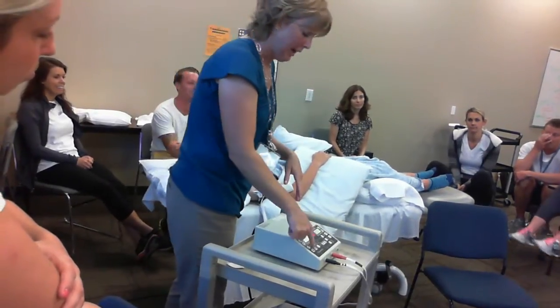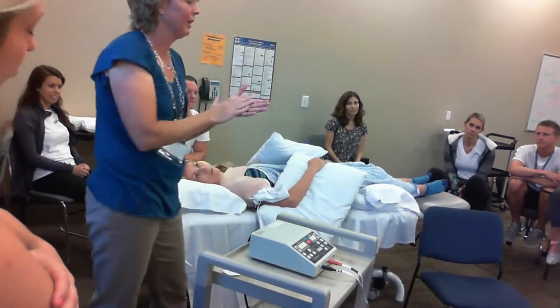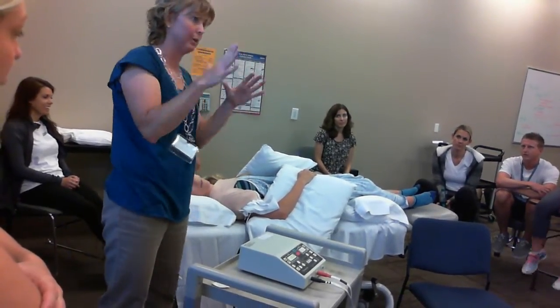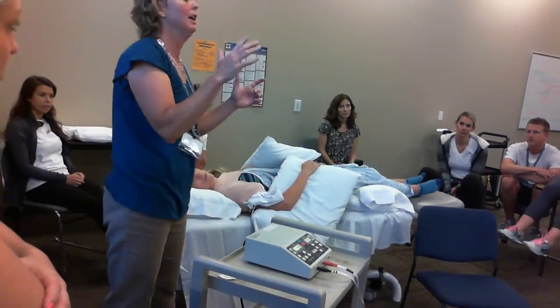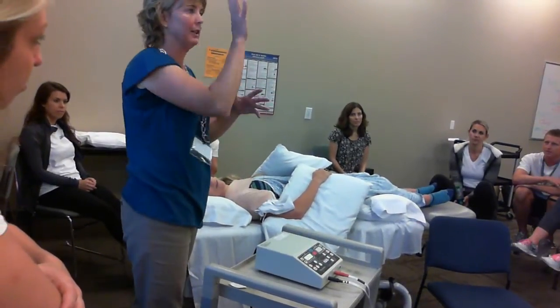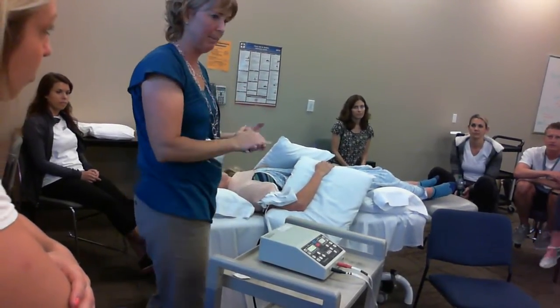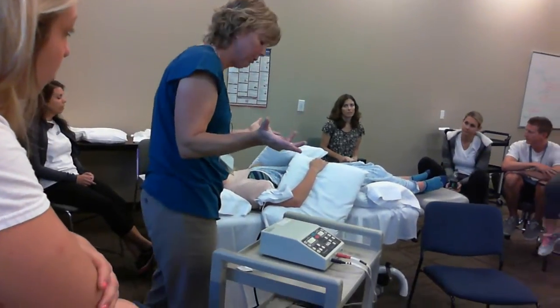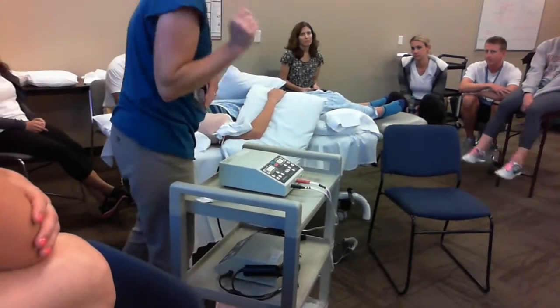Nothing's going to change. If I hit scan, it's going to change the amplitude of one, and so it's going to feel like it's getting louder somewhere else. Okay, it's going to feel that whole speaker, remember, analogy I gave? So it's going to feel like it's moving. And if I hit sweep, it's going to feel even a little bit different to her, based on the machine that has this patented sweep mode to it, okay? And so we'll go with true first, just so that you can feel that one, and then we'll change it and tell us if you feel anything different.